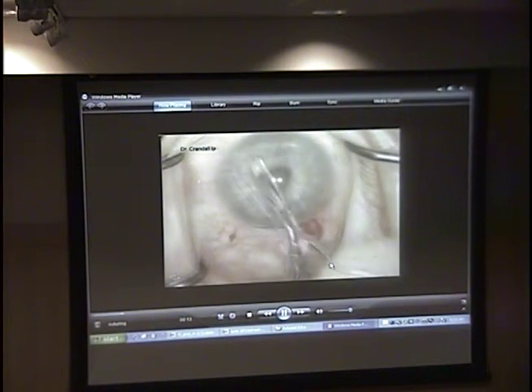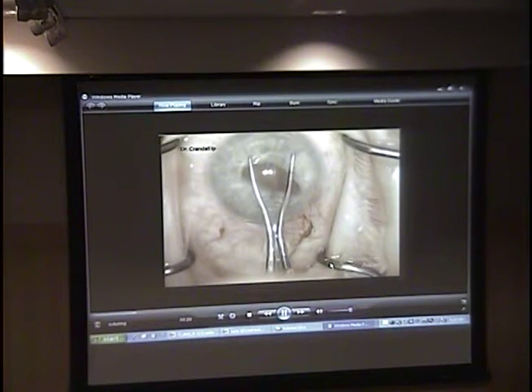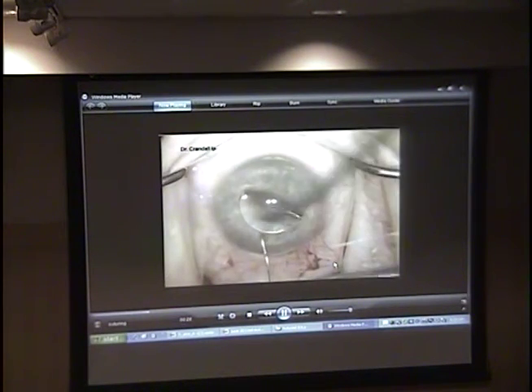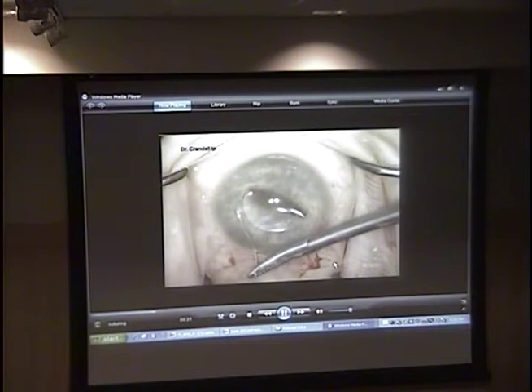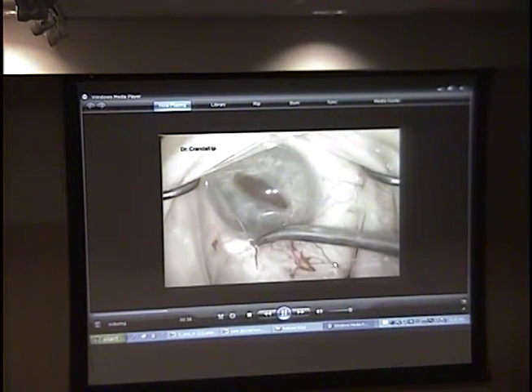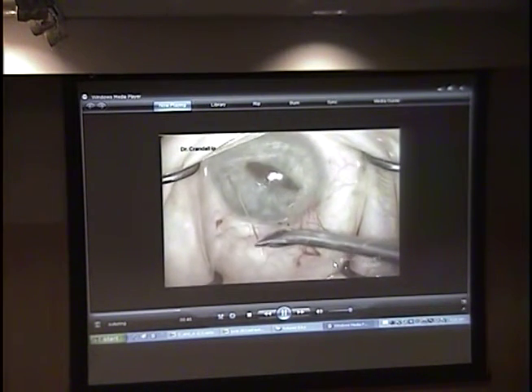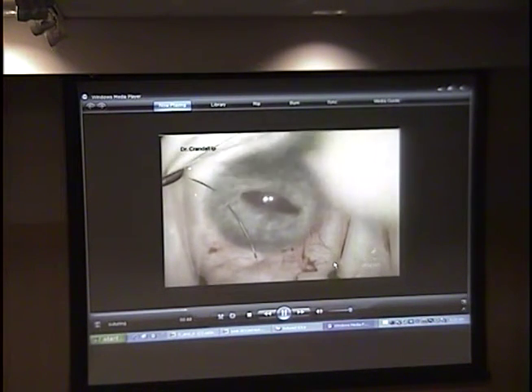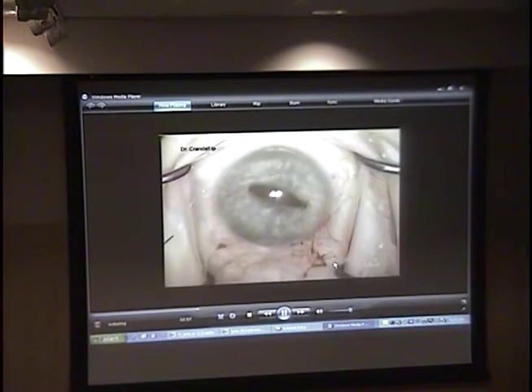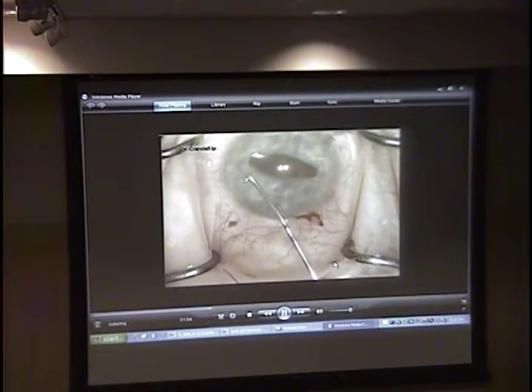So this is just showing a folded IOL, directing the haptics vertically, opening it so that it's captured in the pupil. It's a Prolene suture going through a corneal wound, through the iris, under the haptic, out through the iris, and then out through the peripheral cornea. And then you use a Kuglen hook to grab the peripheral suture and bring it towards your wound.